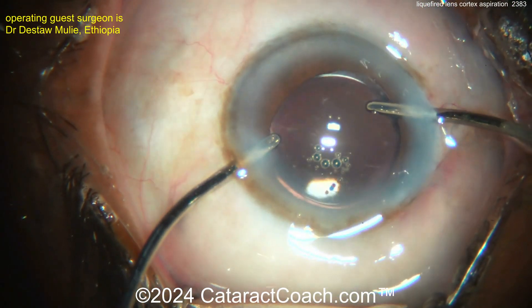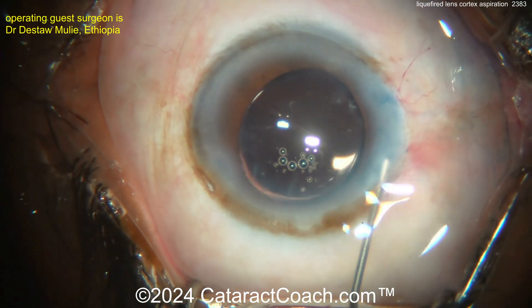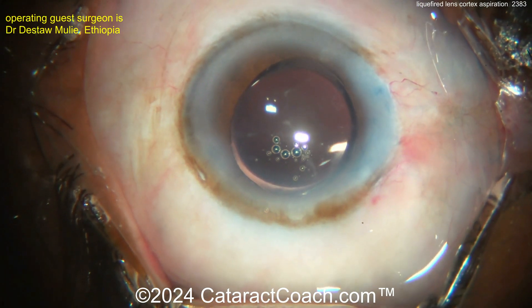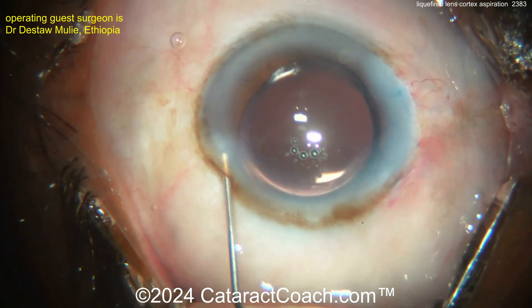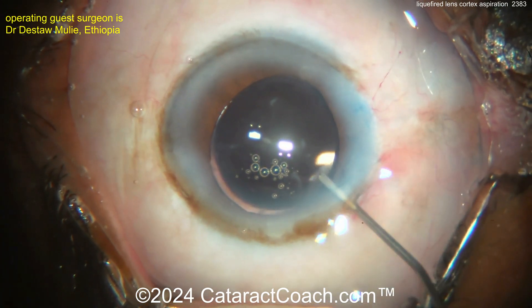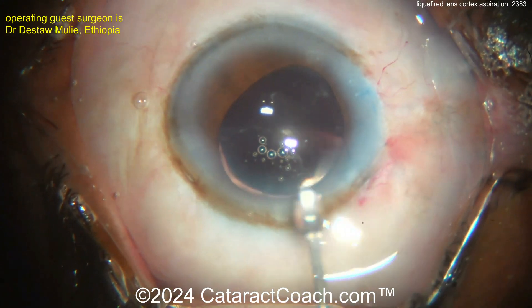What does a shorter axial length mean? It means you'll calculate a slightly higher IOL power than needed for emmetropia, so the patient may end up a little myopic. That's okay — this patient with bilateral white cataracts will be thrilled if they end up plano, and equally thrilled at minus one. In fact, minus one is probably more useful for around-the-house vision, and I think it's a great result for a monofocal lens.